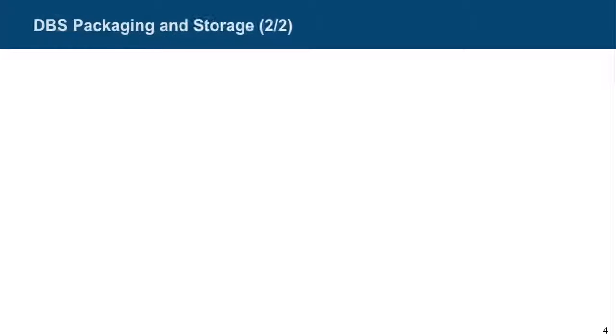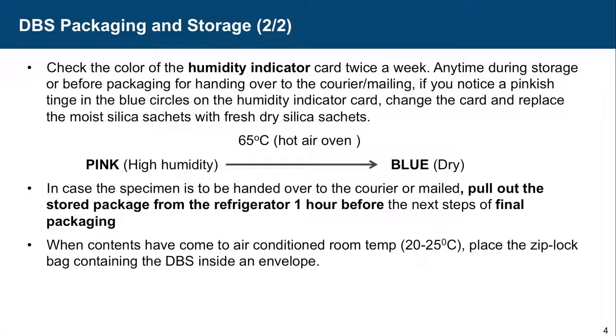Check the color of the humidity indicator card twice a week — when the cards are in the refrigerator and before packaging for handing over to the courier. If you notice a pinkish tinge in the blue circles of the humidity indicator card, change it and replace the moist silica sachet with a fresh dry silica sachet. You can recharge the humidity indicator card by putting it in a hot air oven at 65 degrees C until the pink spots turn blue, and then reuse them.